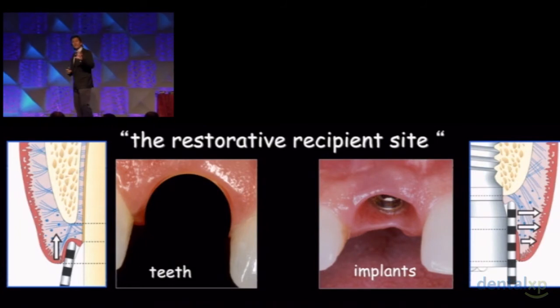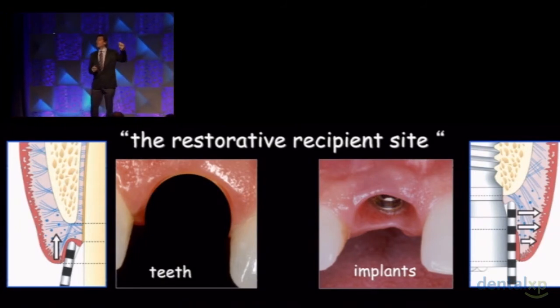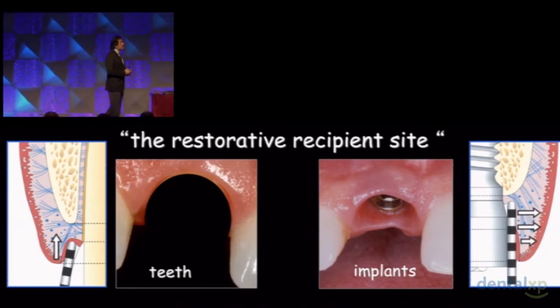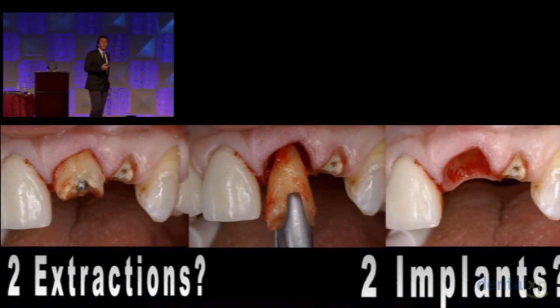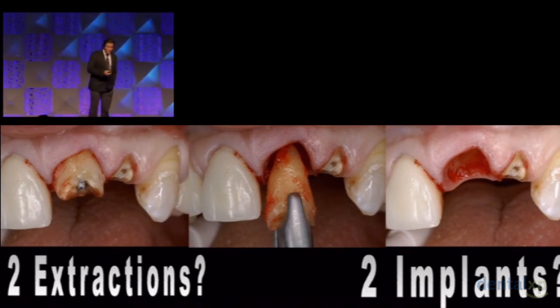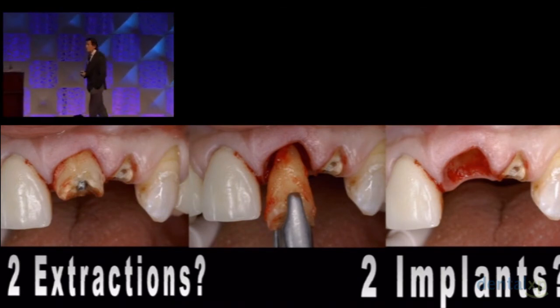We just remove the crown of the tooth, and we maintain the root 1 millimeter above the bone. It would retain the socket completely, and it would retain those supracrestal fibers that can maintain the soft tissue. This is something we introduced with our friends and colleagues in Japan, Tom Ishikawa, as well as Aki Funado. And I have a lot of friends that come from Japan that I've had the opportunity of working with.